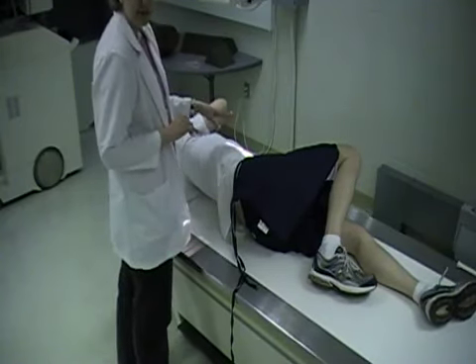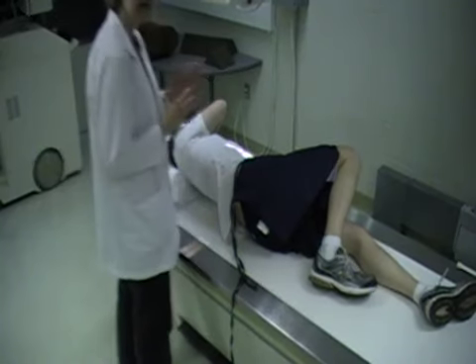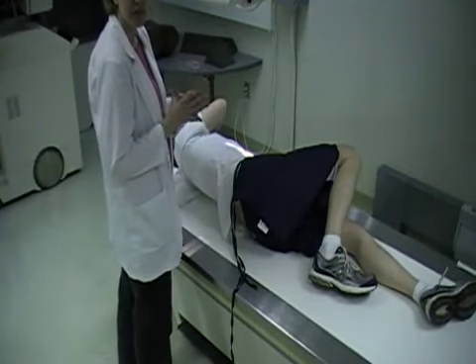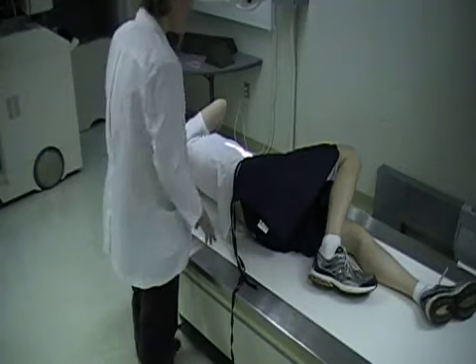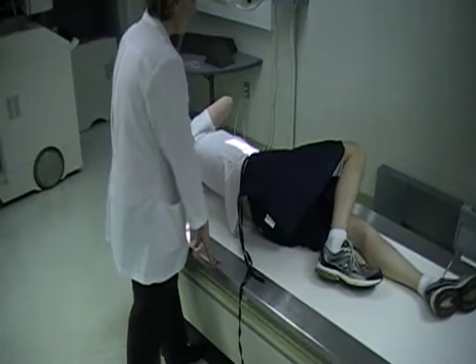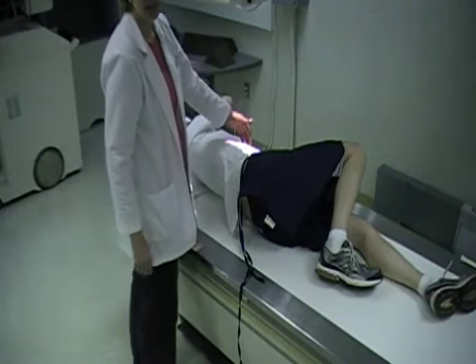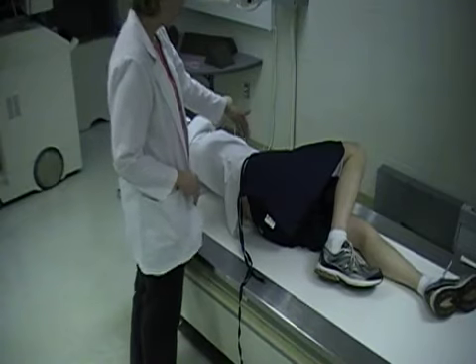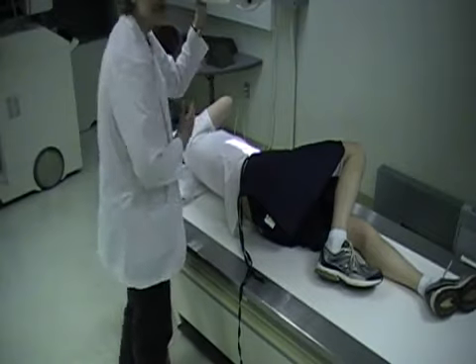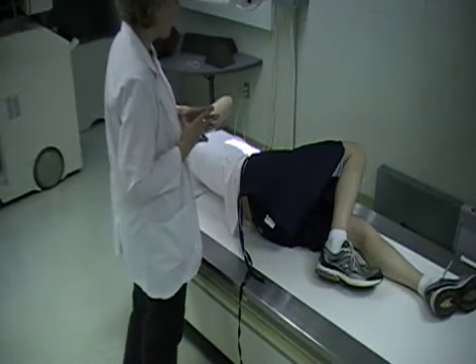Now, what you have to be careful about, if you are using the automatic exposure control, sometimes it does cut off too early when you're centering on this. So sometimes with the AEC, I like to come posterior and center more at the area midline with the xiphoid, just so you don't get that early cutoff. If you're using a manual technique, then that previous position will work just fine.